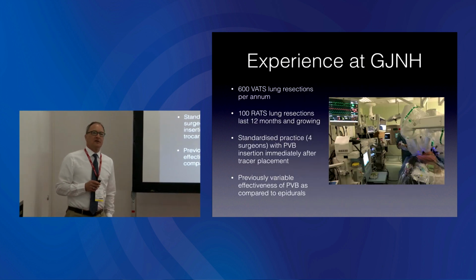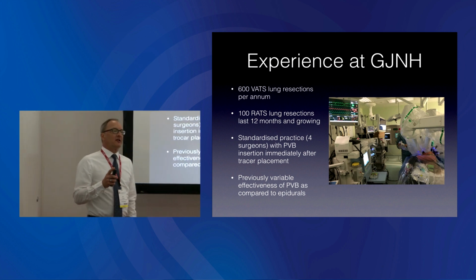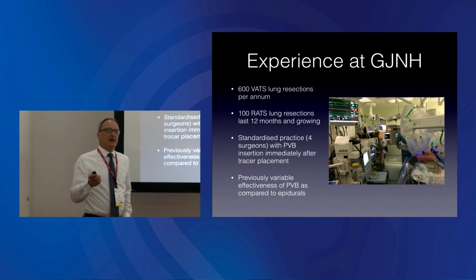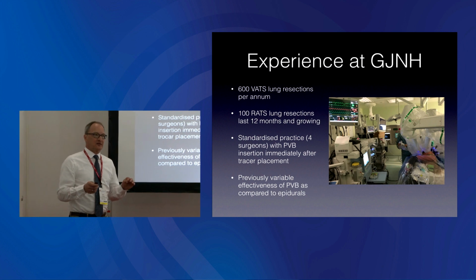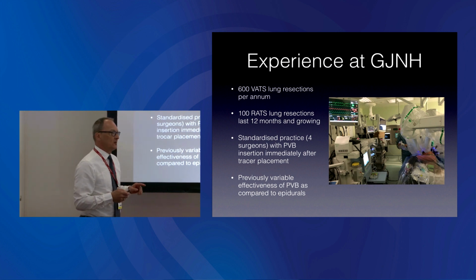Why is that important? In clinical practice, local anesthetic techniques have long been used, published, compared, but if you look at the literature, there is very, very little standard by which you can actually derive whether the blocks in these groups have actually worked.